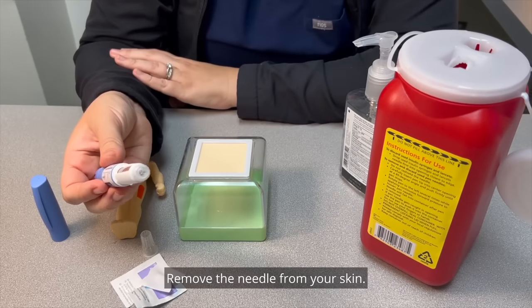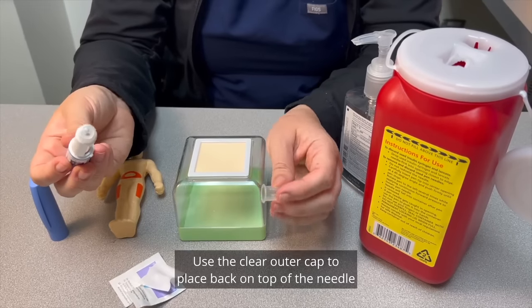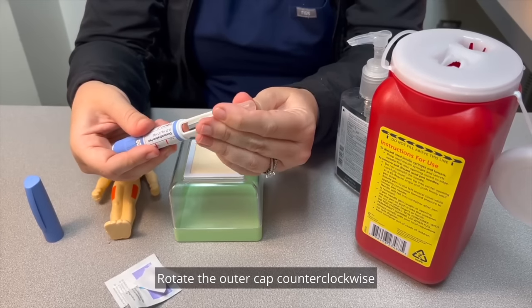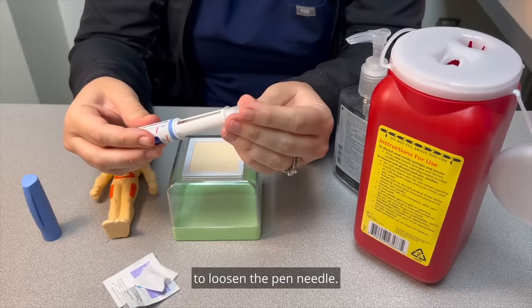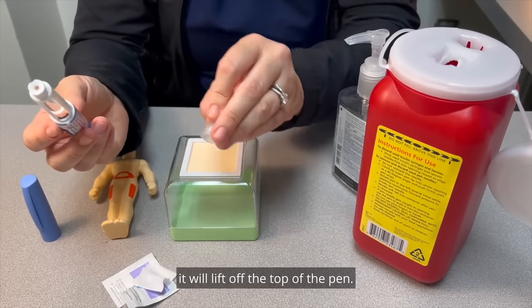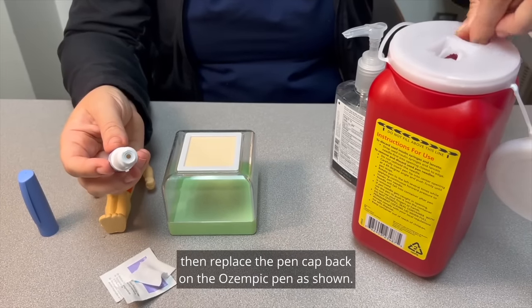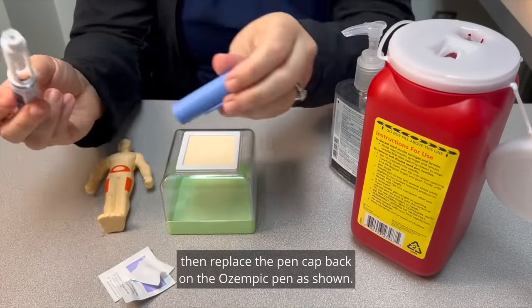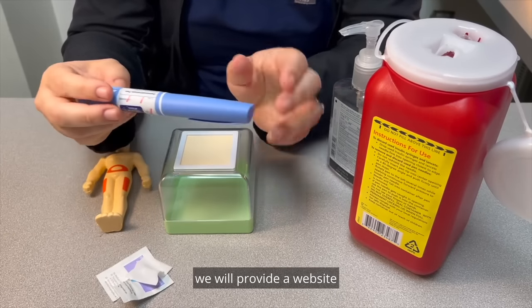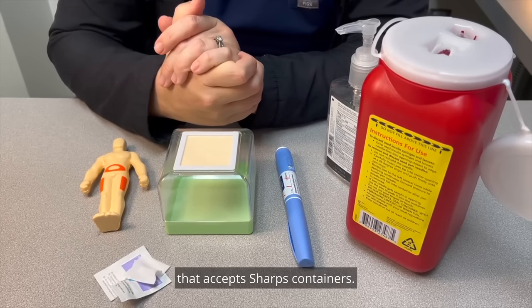Remove the needle from your skin. Use the clear outer cap to place back on top of the needle when it is firmly in place. Rotate the outer cap counterclockwise to loosen the pen needle. When the pen needle is turned loose, it will lift off the top of the pen. Place the used pen needle in a sharps container, then replace the pen cap back on the Ozempic pen as shown. At the end of this video, we will provide a website where you can easily locate a nearby facility that accepts sharps containers.